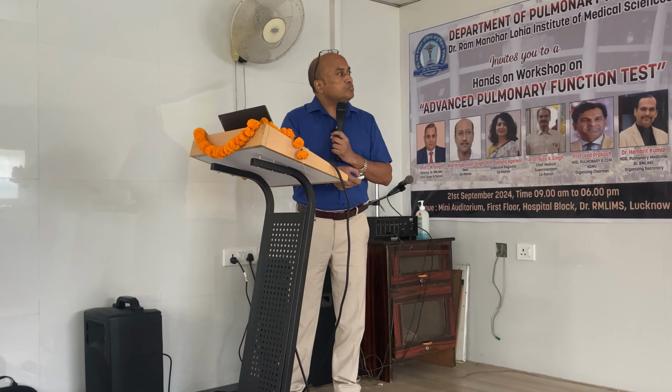We have seen in the previous lecture there are physiological parameters that we see during spirometry. After seeing patients in our clinics, we many times ask them to go for the lung function test, and the basic lung function test is spirometry. Many parameters we see in spirometry are flow rates, and definitely the forced vital capacity, FEV1, mid expiratory flow rates, peak expiratory flow rates, all these things.